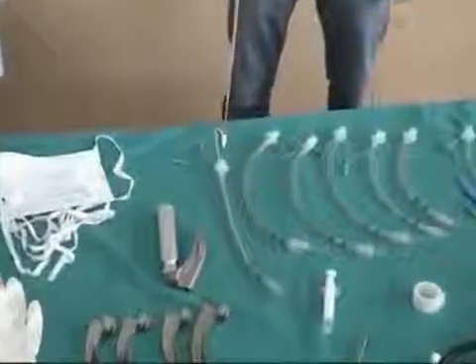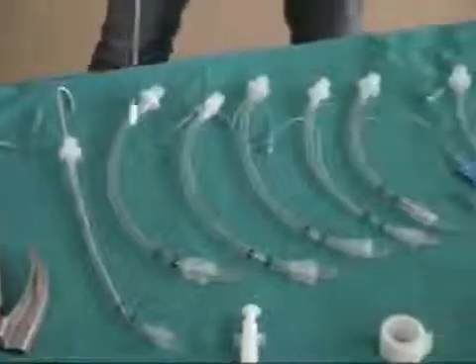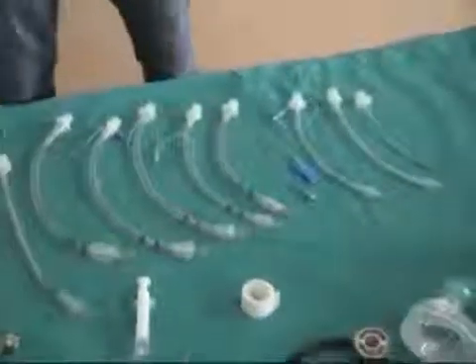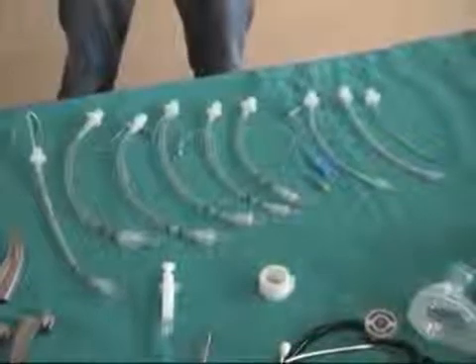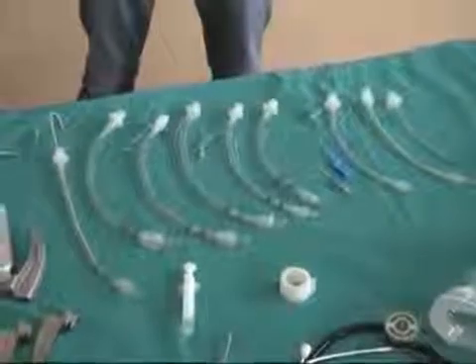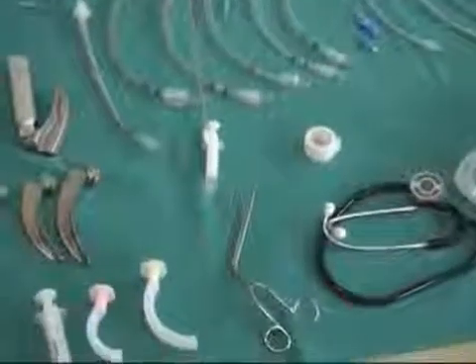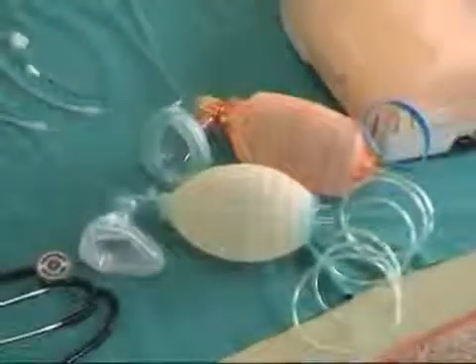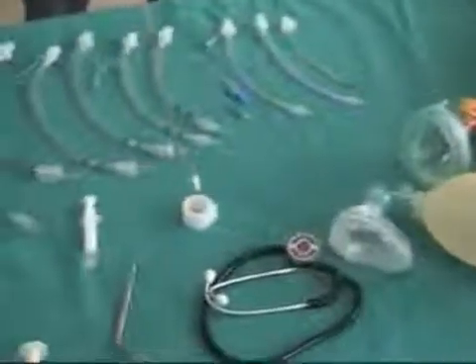There are several sizes of endotracheal tubes according to their internal diameter, but 7, 7.5 and 8 are usually appropriate for most adult patients. A 10cc syringe, a bag valve mask attached to oxygen, tape or endotracheal tube holder, stethoscope.